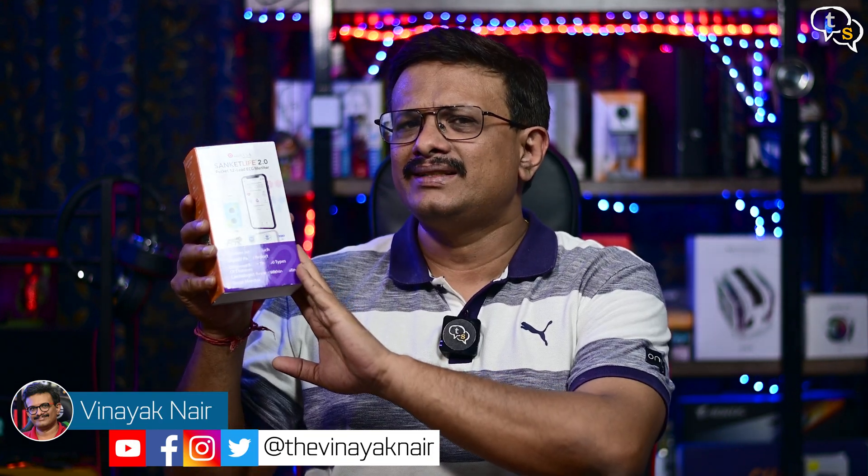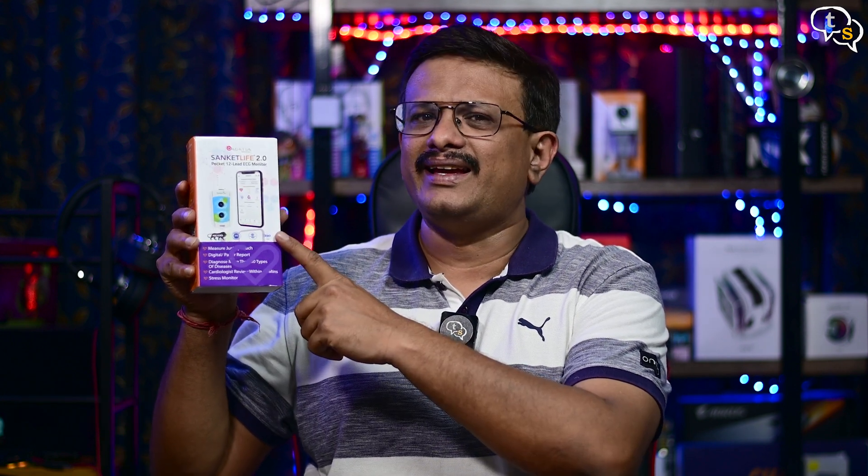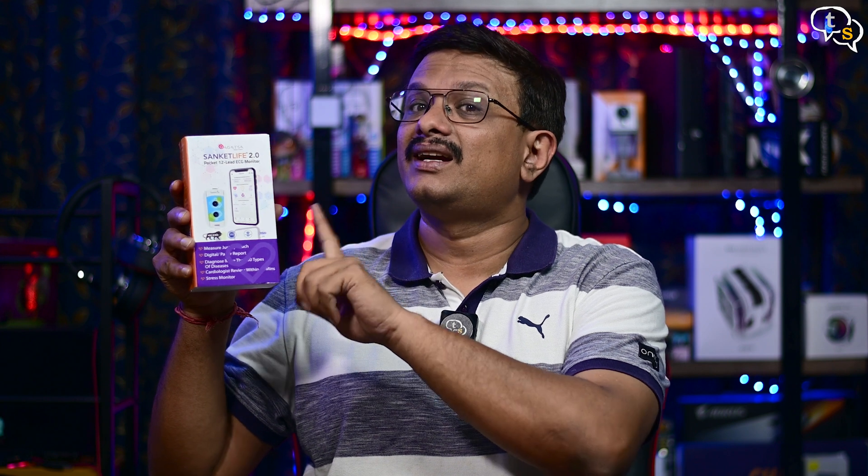Hey everyone, Vinayak here. Today I have with me another medical grade device, and this is the Agastah Sanket Life Pocket ECG monitor. It's supposed to make taking ECGs easier, so let's check it out.